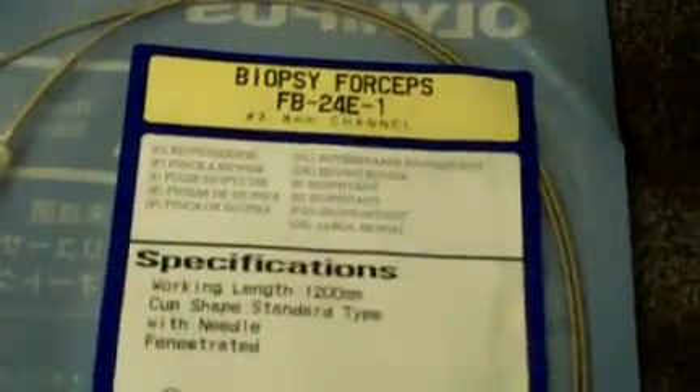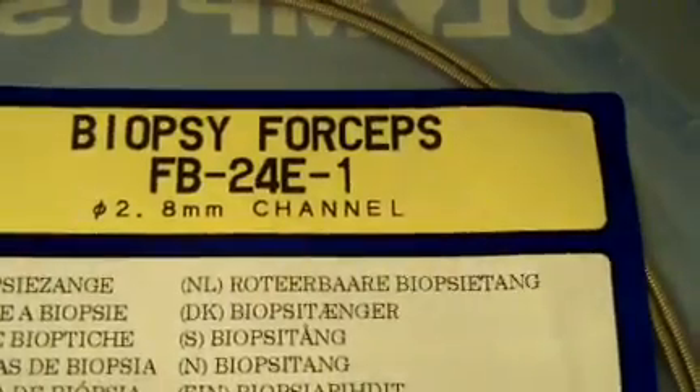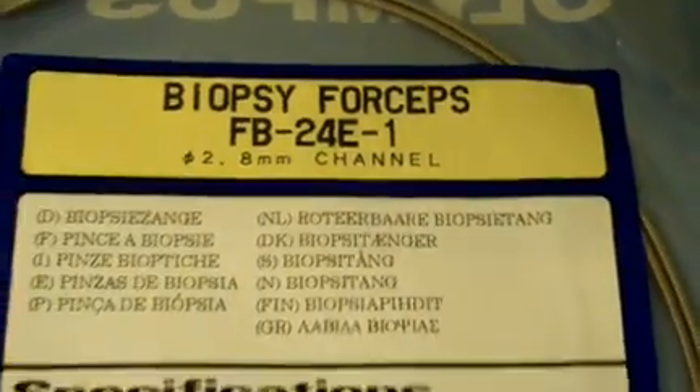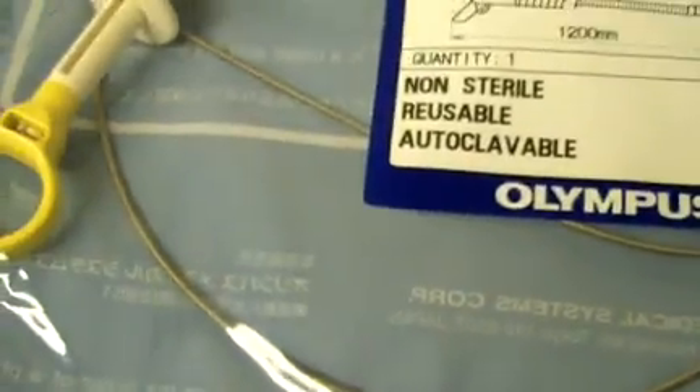From DCSP Medical, we're looking at some Olympus biopsy forceps. They're the FB24E1, 2.8 millimeter channel. They are in the original packaging, sealed, brand new.